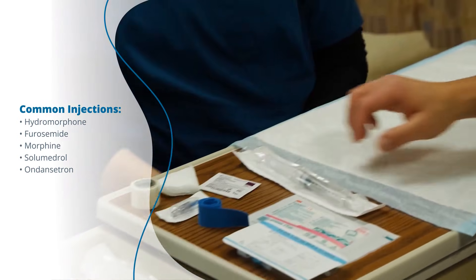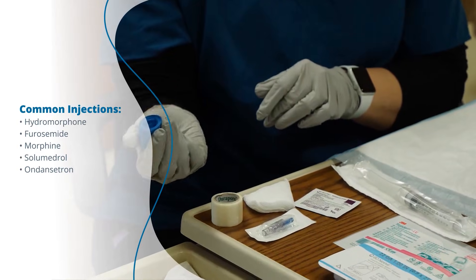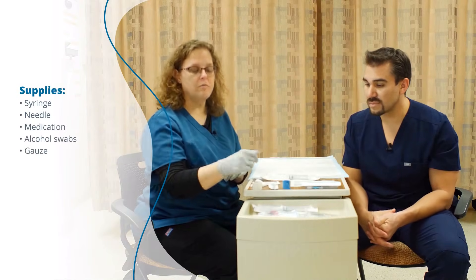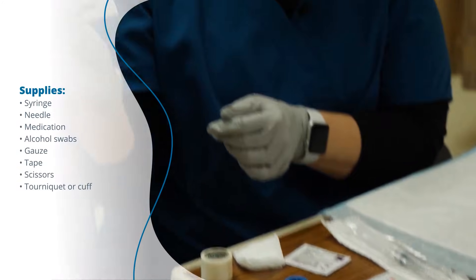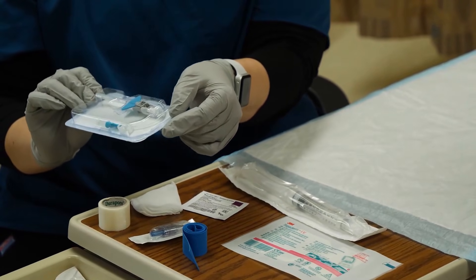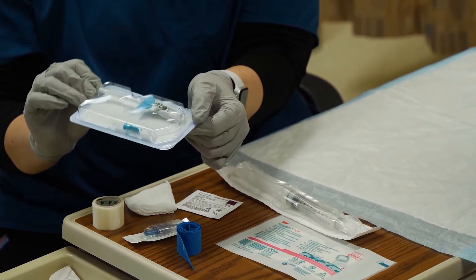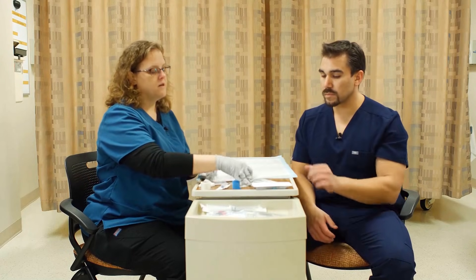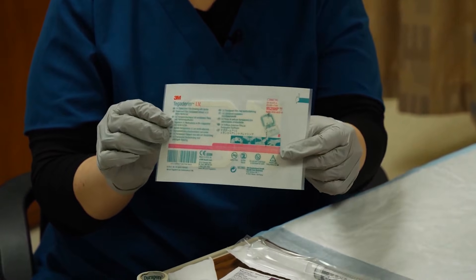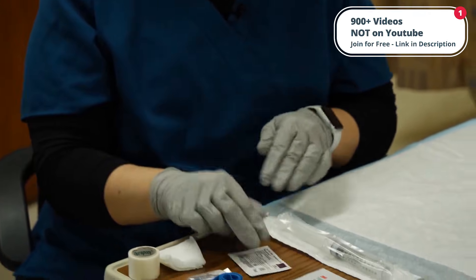So what are we working with today in terms of ingredients? We have standard silk tape, a tourniquet, and if your patient has very fragile veins, you can actually just use a blood pressure cuff. If they have very large veins, you may not need a tourniquet at all. We have a Luer-lock device to cap off the pigtail, the IV catheter with the pigtail attached — though most devices come with them separate — a saline flush to flush the pigtail, tegaderm to cover the site completely, and antiseptic and gauze in case of bleeding.